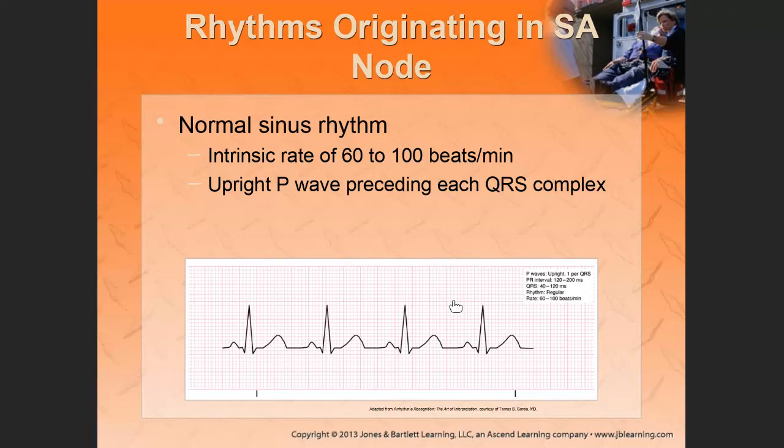Note what I just said, people. Take a piece of paper, mark off the first and second QRS complex on that piece of paper and then move it down the ECG to see that all the complexes line up.